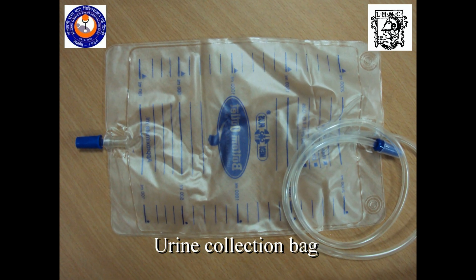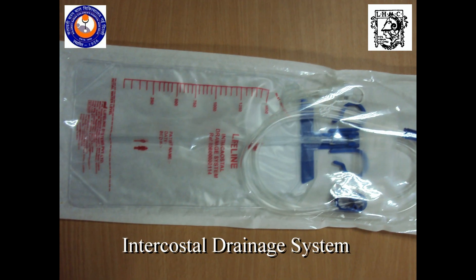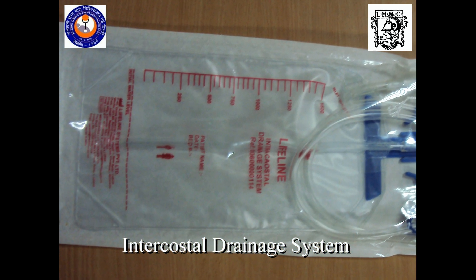Urine collection bag, intercostal drainage bag.